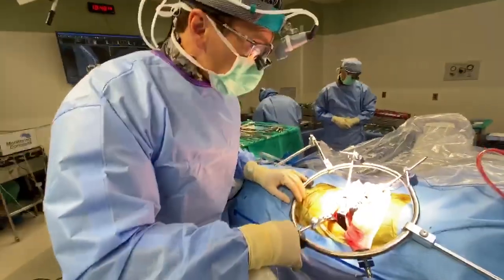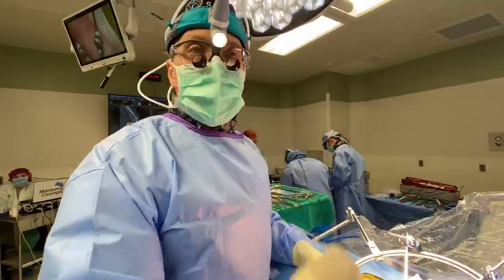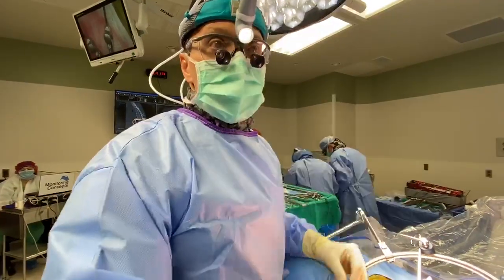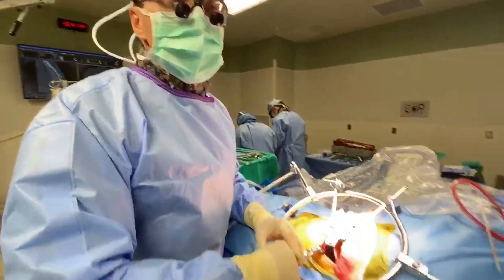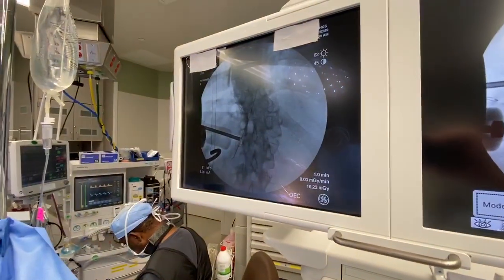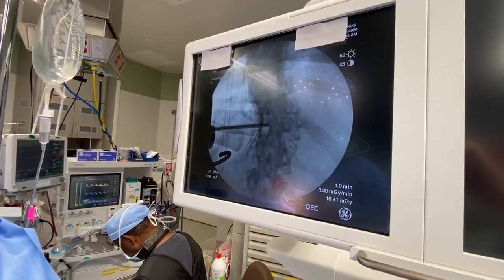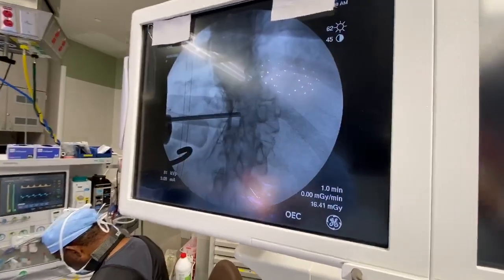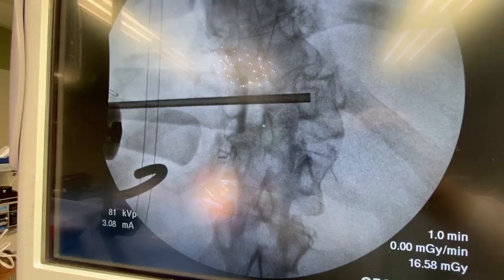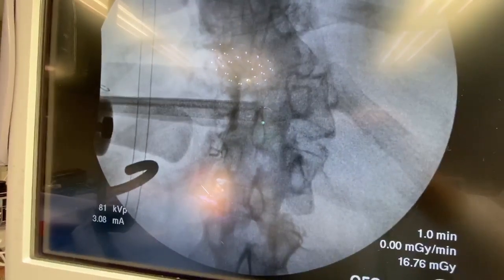What we've done is taken out the entire triangular shape on my side, on the left side, and then a portion of the triangle on the opposite side, all the way down to the bone. If you look at that image on the screen, you can see a little bit better — you can see my suction tip. It goes all the way down to that bone on the far side. So now there's an entire gap from here to here.